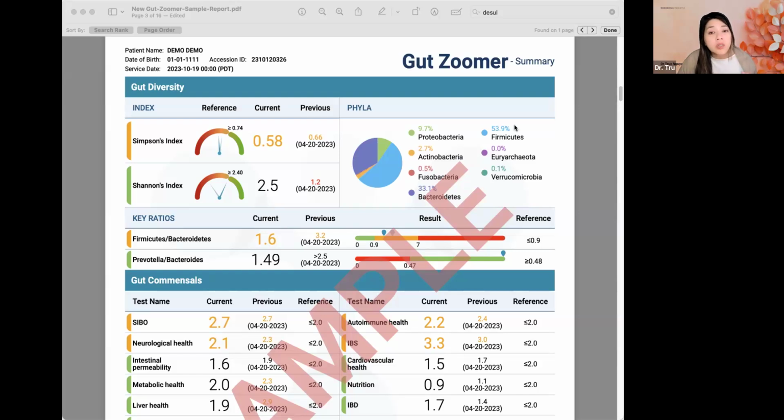They can also be considered opportunistic bacteria, meaning that at low numbers, they don't really cause any problem. They're actually critical to the function of the gut microbiome, but if they overgrow, that's when they become opportunistic bacteria that can cause disease. We're going to go deeper into these a little bit later.